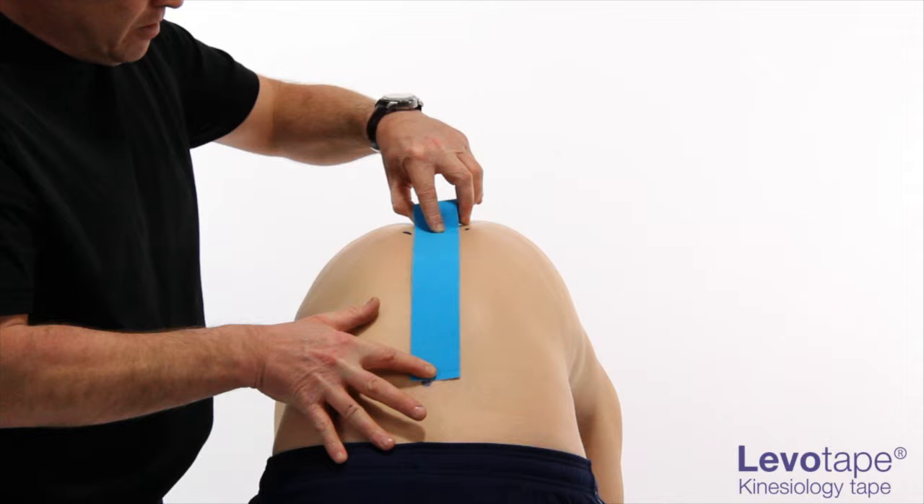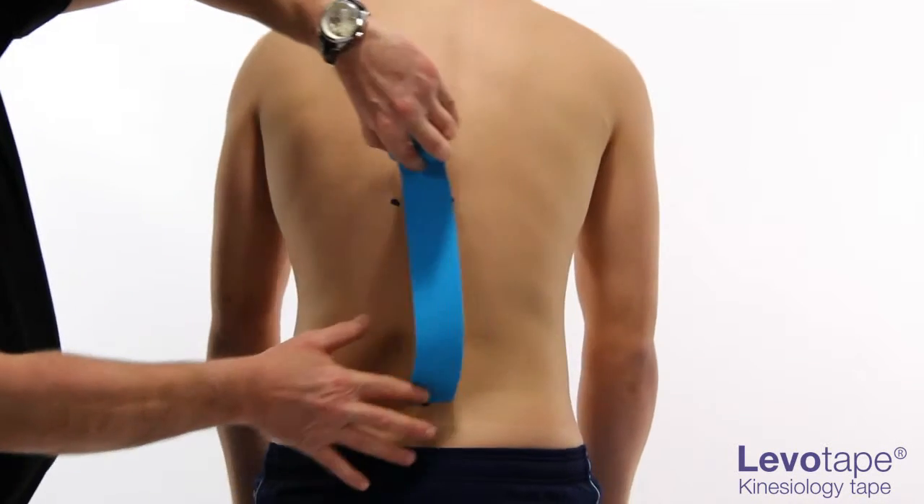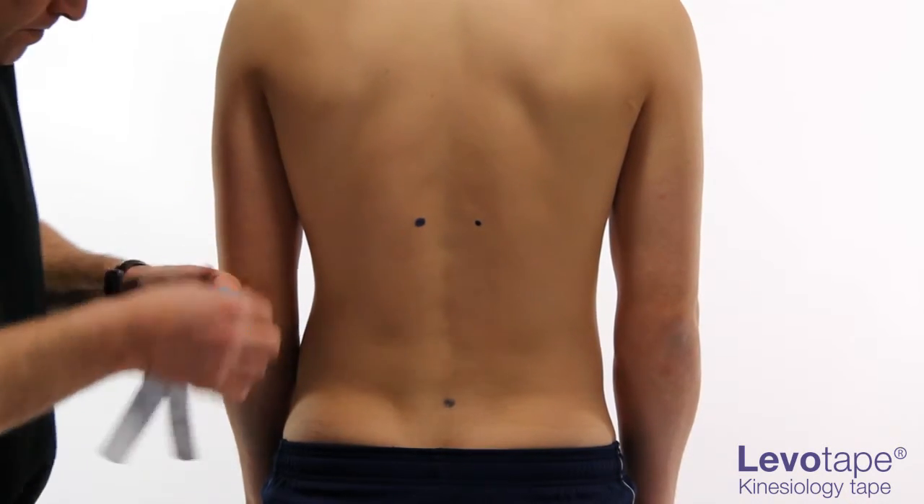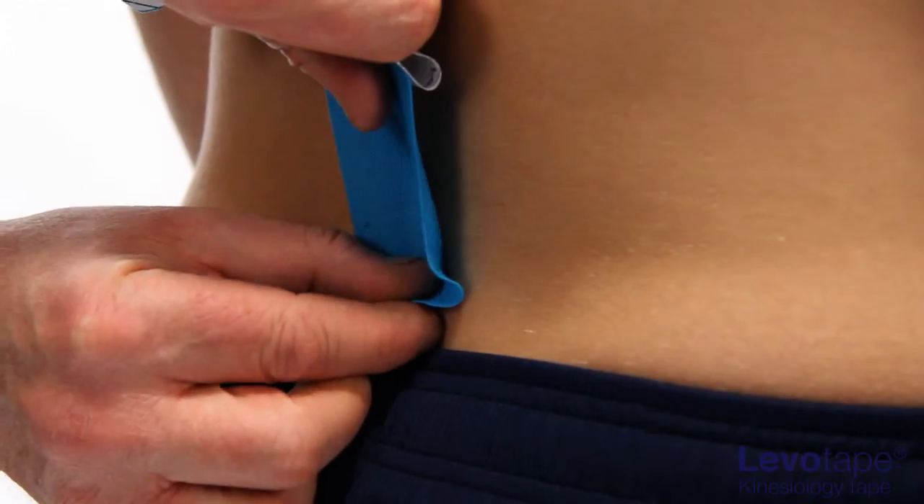Cut and prepare a Y-strip to the appropriate length. Peel back approximately 3-4 cm of backing paper from the tape.